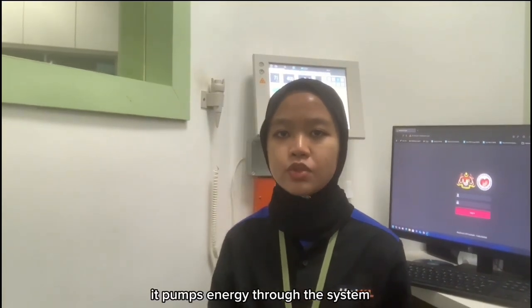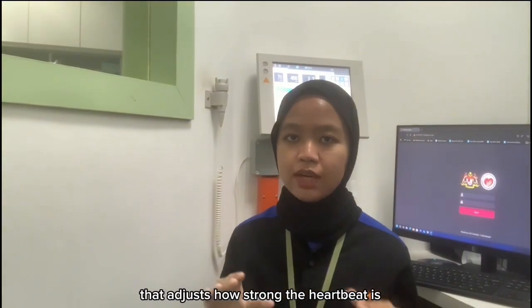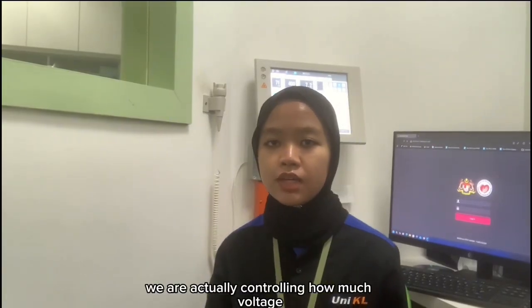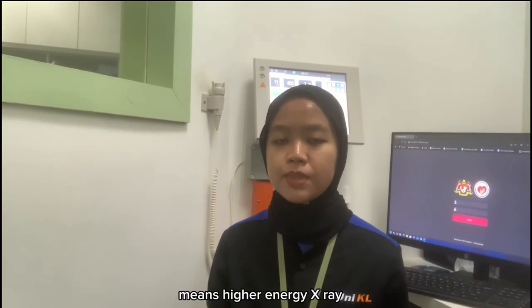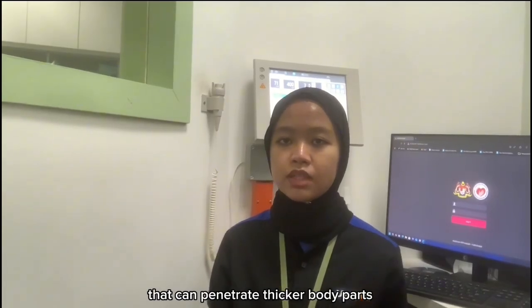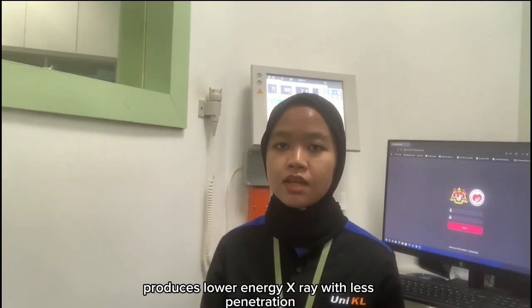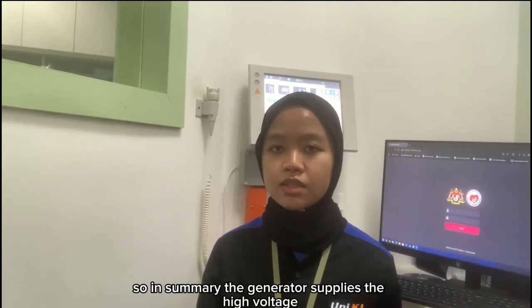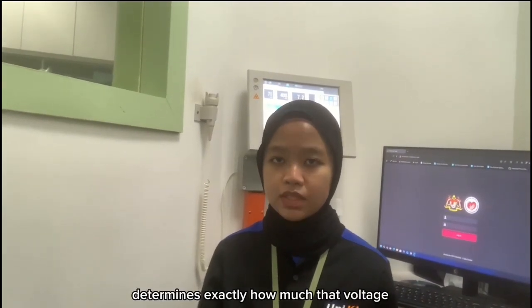You can think of the generator as the heart of the X-ray machine. It pumps energy through the system, and the KVP setting is like the pressure control that adjusts how strong the heartbeat is. When we set the KVP on the control panel, we are controlling how much voltage the generator sends to the tube. A higher KVP means higher energy X-rays that can penetrate thicker body parts, while lower KVP produces lower energy X-rays with less penetration. So in summary, the generator supplies the high voltage and the KVP setting determines exactly how much of that voltage is used to create the X-ray beam.